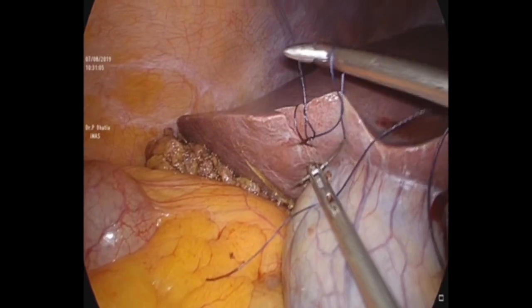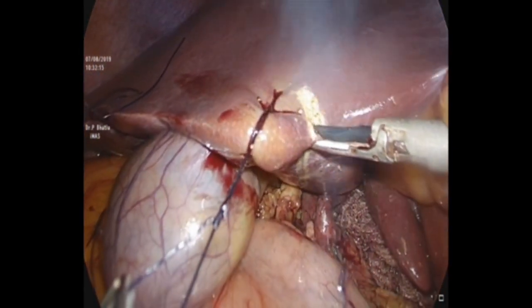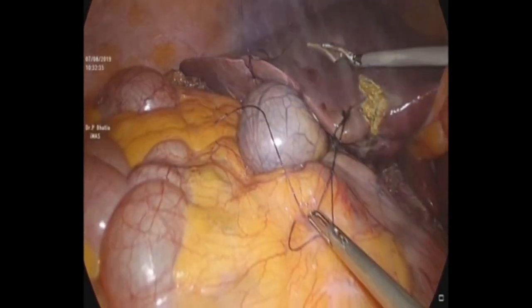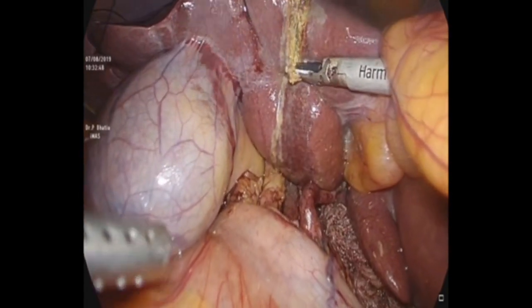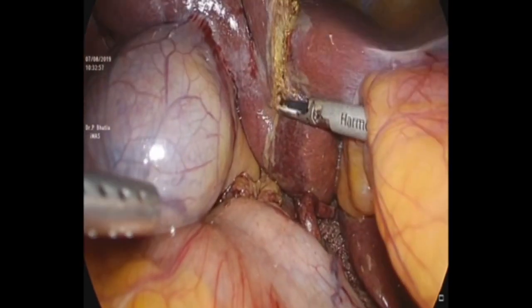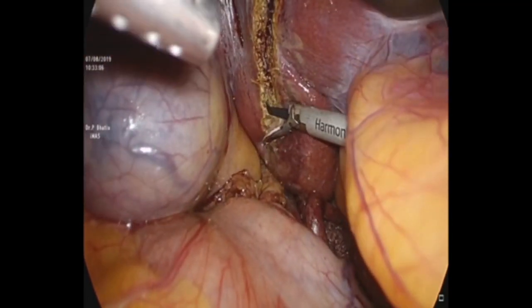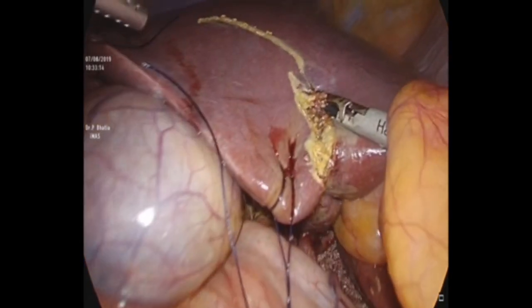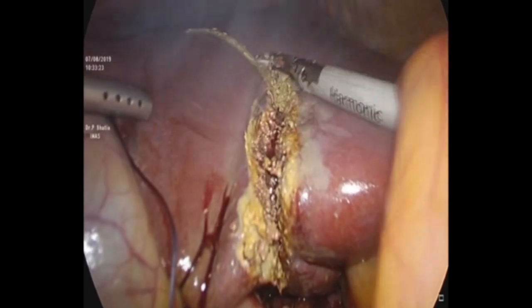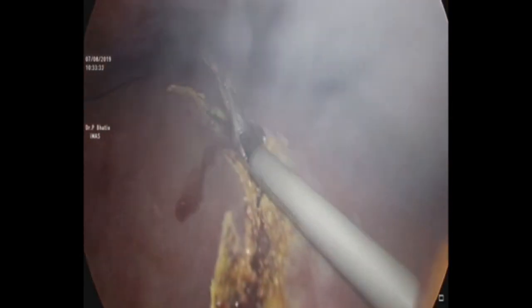With the help of energy sources — specifically this is the Harmonic HD integrated handpiece, which we call the HD 1000I — we go all around. The trick is that we should remain perpendicular to the tissues. The most common mistake a surgeon can make at this stage is that as we go deep into the liver, we can drift more towards the gallbladder fossa and the margin will no longer be 2cm. So the key is to remain absolutely perpendicular to the initial scoring line made with the Harmonic HD 1000I.